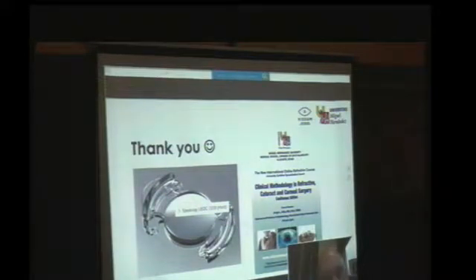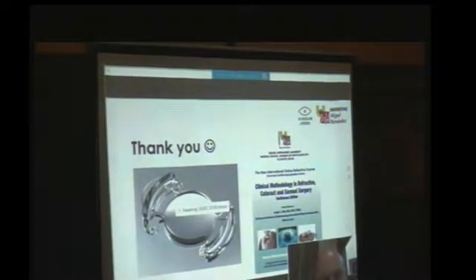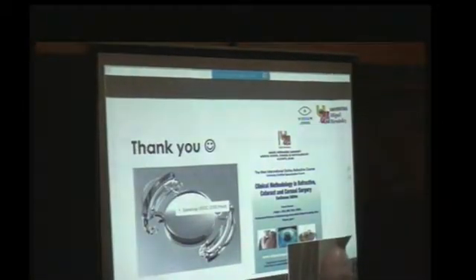I'm guessing only. And in terms of hyperopes, definitely, if we have an abnormal configuration of the anterior segment, we are not implanting. But for standard cases, there is no limitation. This lens obviously has no toricity, and if you have a toric component of the refraction, you have to combine it with corneal refractive surgery.